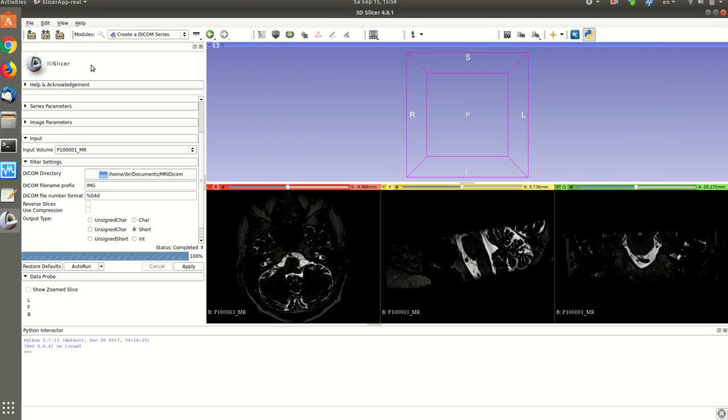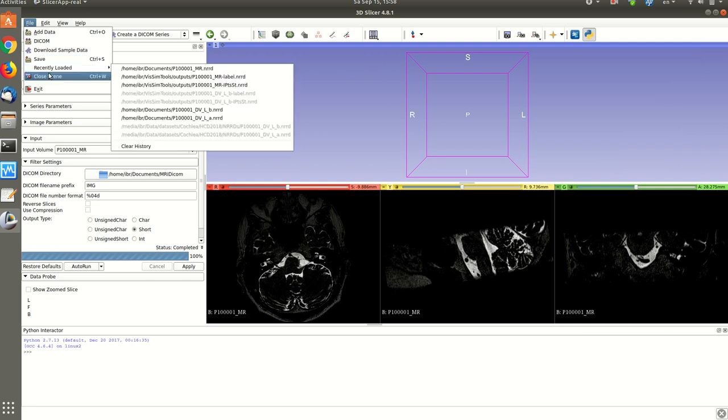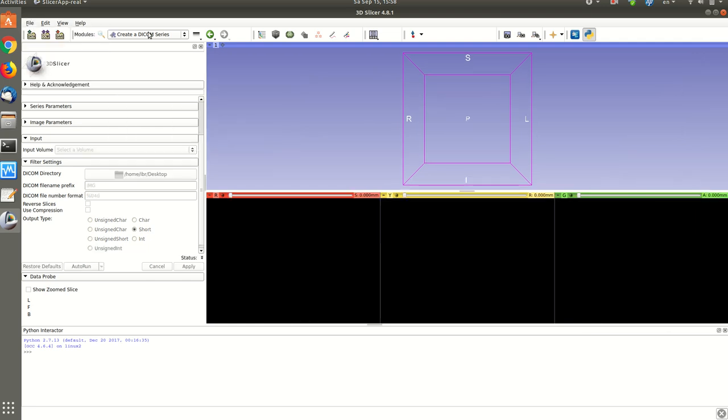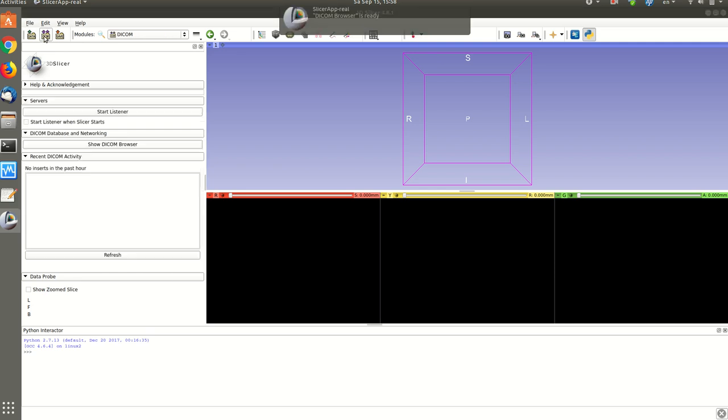So how do we do the opposite? It's very simple also. I'll just close the scene. And what I'm gonna do is convert from DICOM to NRRD. So all we need to do is click on this DICOM module.